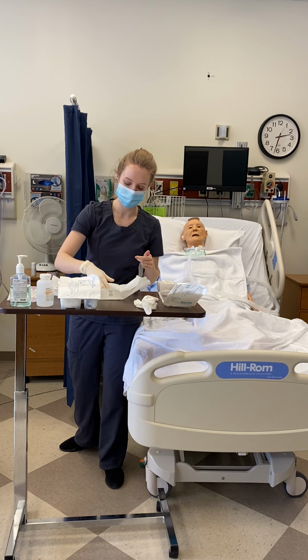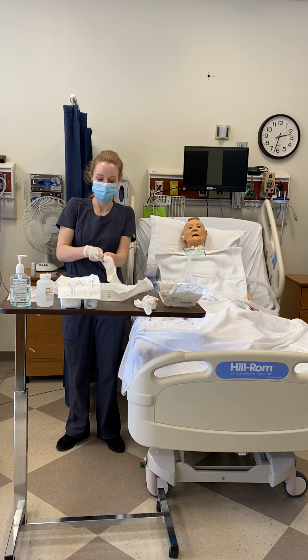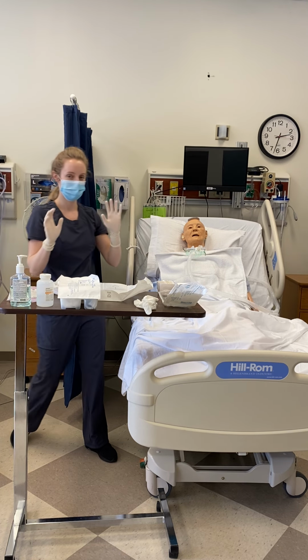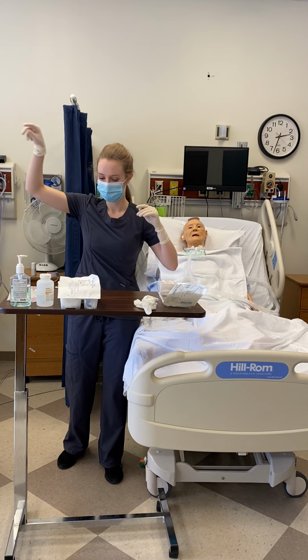Cuff rolled a little bit there. I would normally get a new pair of gloves, but for the sake of this video, I'm just going to proceed. Okay, so I may have broken sterility there. Again, I'm just going to proceed for the sake of this video.